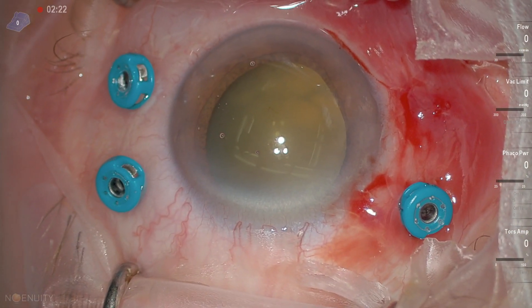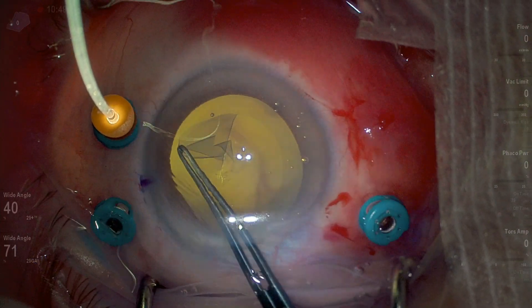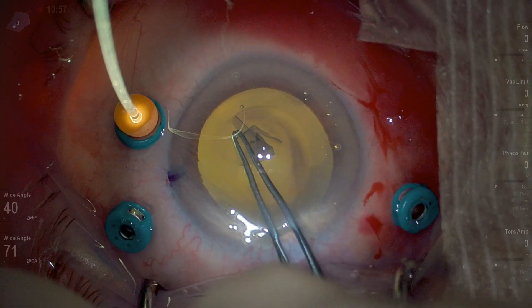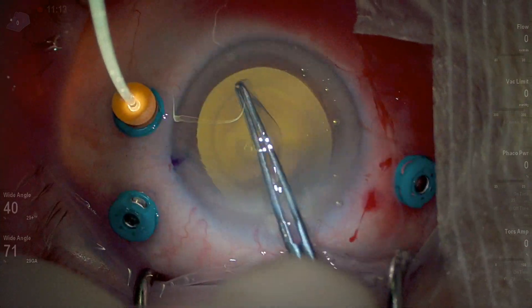There's no red reflex — it's a very yellow reflex from the dense chronic vitreous hemorrhage. The resident chose to stain the capsule with TriPan Blue, as well as using retroillumination.